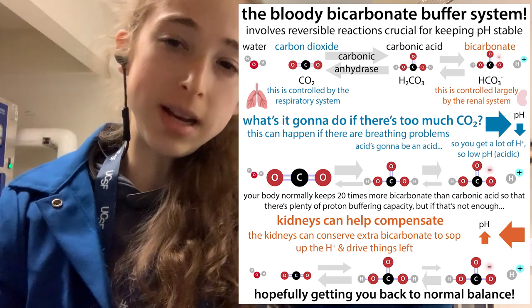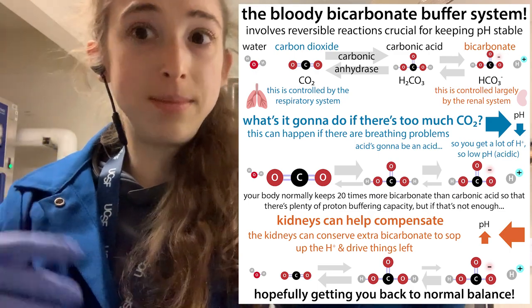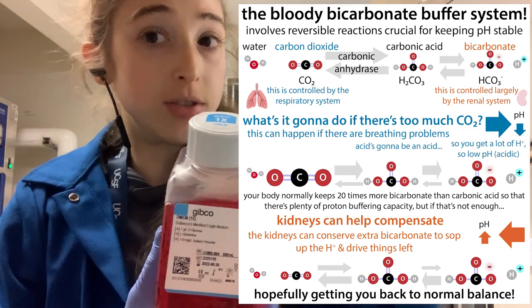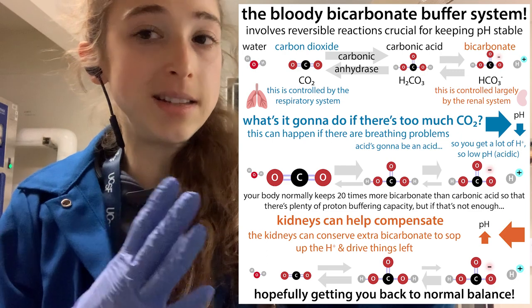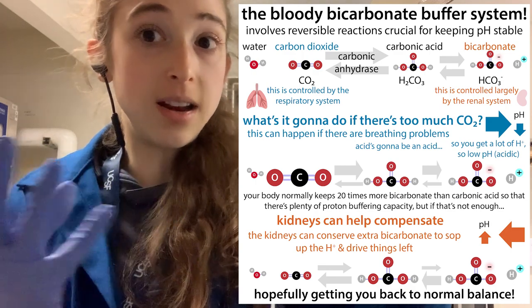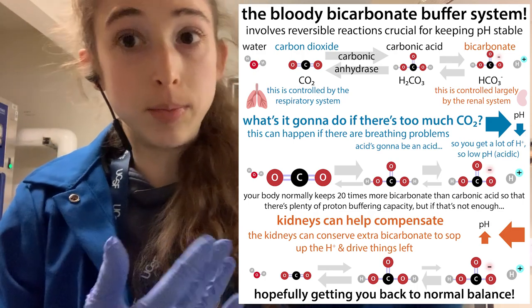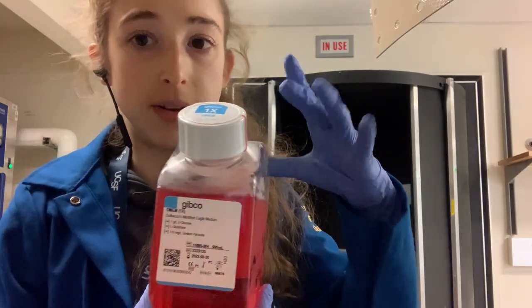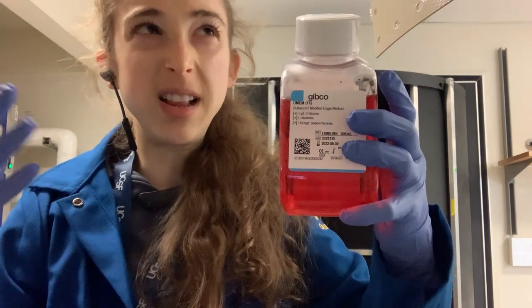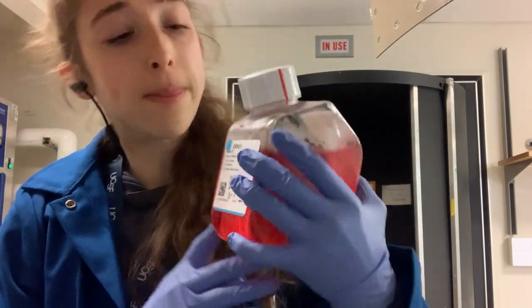When media turns orange or yellow, it's time to either change out the media — just suck it off and add new media — or potentially split the cells, dilute them, and replate them in fresh media. If the pH gets too high and you get basic conditions, it can actually turn purplish — a darker color. This can happen if you're working outside of the incubator for a long time because you're not in that CO2 environment. Phenol red is the pH indicator, though there's some push to get away from it — it can mimic estrogen and interfere with a couple of things.